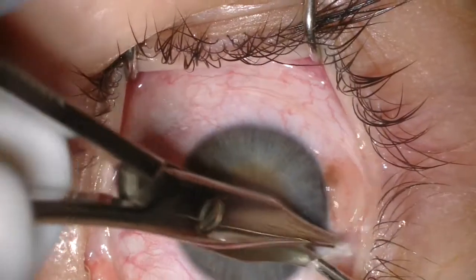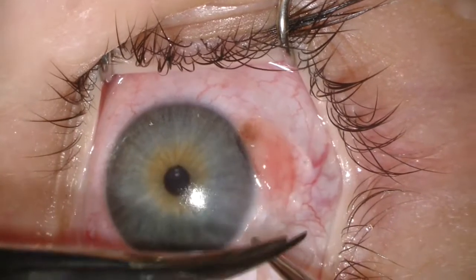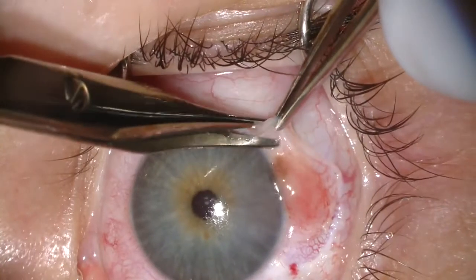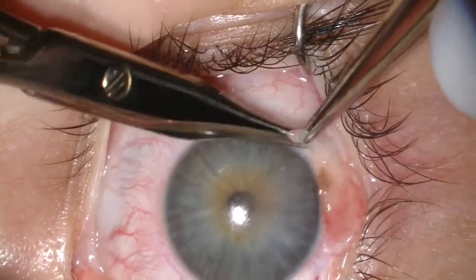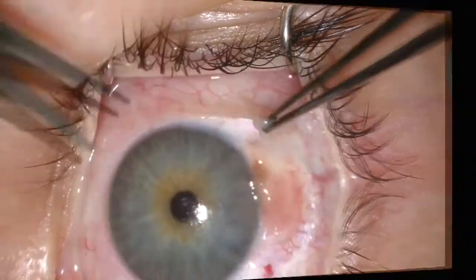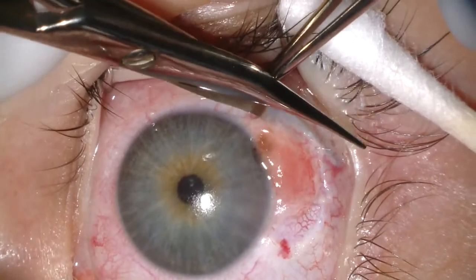We then excise with a 2mm wide margin using the no-touch technique, meaning we never touch the tumor — we're always handling normal conjunctiva outside the tumor. We take our incision through conjunctiva and Tenon's fascia down to bare sclera, as we don't know how deep the nevus extends.